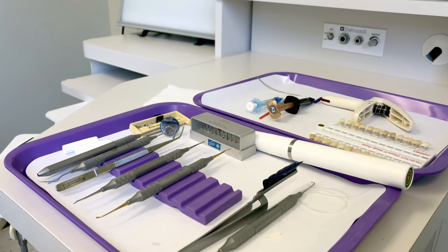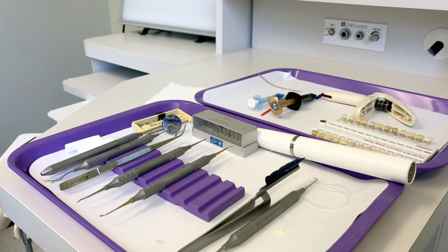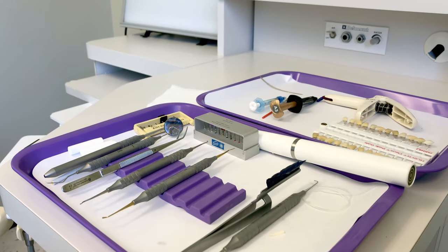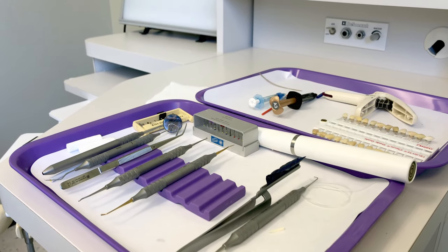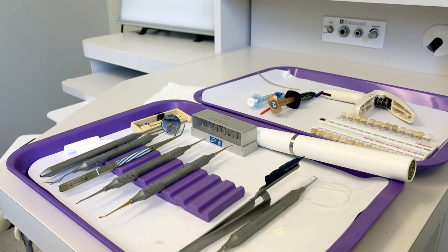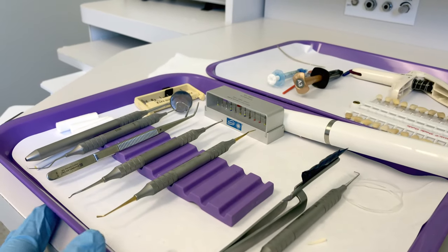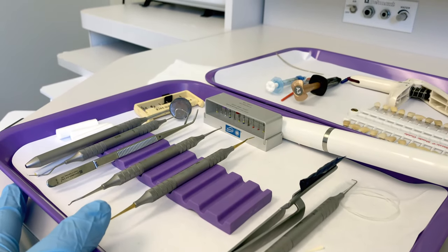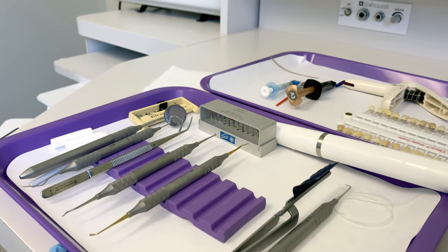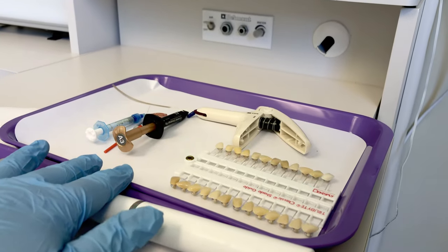This video will show you the dental assistant's responsibilities during a composite procedure. We have a tooth that's already been prepared; we will be working on tooth number 10, which has a class four preparation. The matrix band is already in place. We have two trays set up: a tray of instruments and a tray behind it with the materials needed for the procedure.